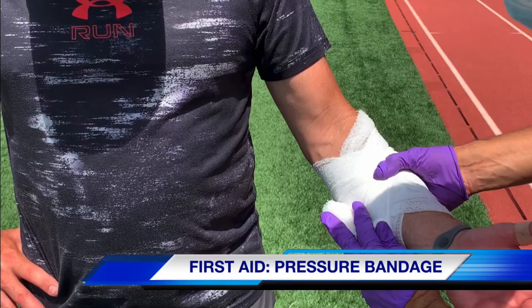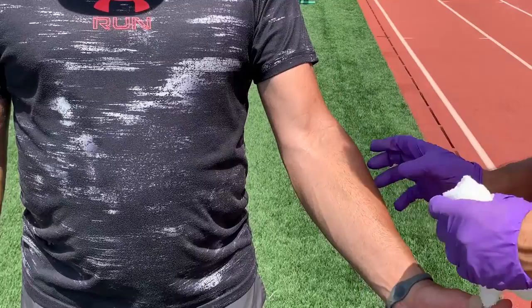Hello, my name is Dr. Kevin Mercado. This video is to demonstrate how to effectively apply a pressure bandage on an open wound.